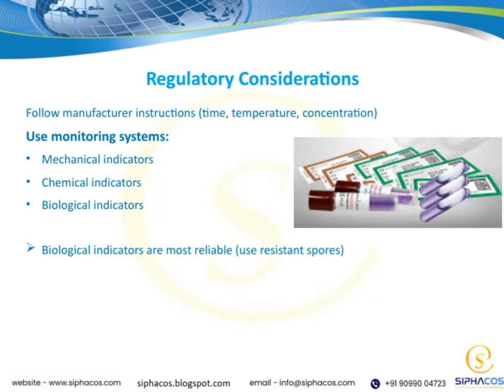Overall, integrating these monitoring techniques helps us stay compliant with regulations and, more importantly, ensures the safety of patients and staff. Remember, thorough monitoring and adherence to guidelines are key to successful sterilization practices.